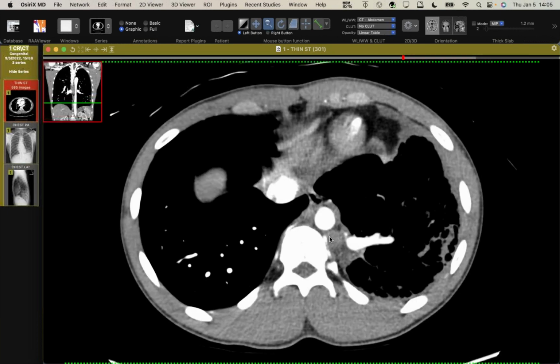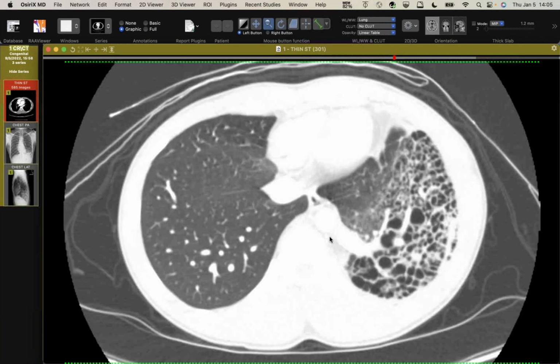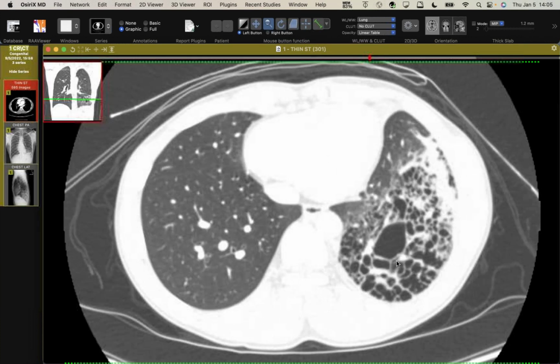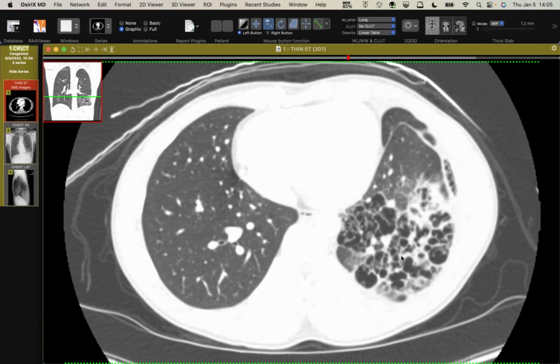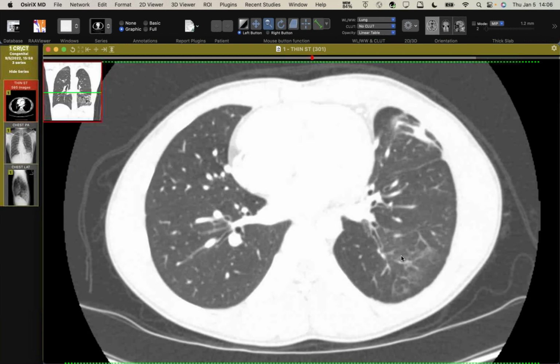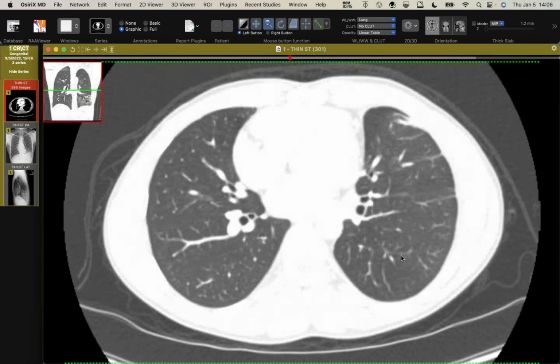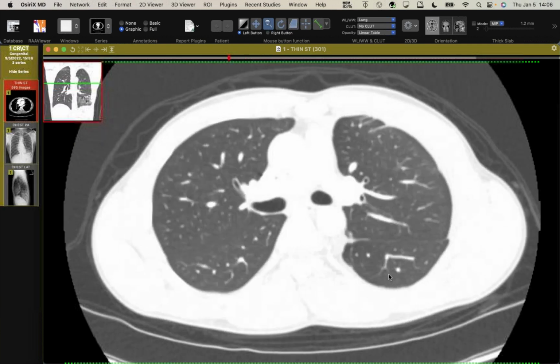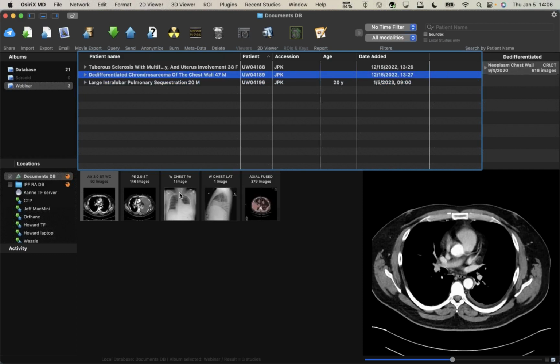that's in this left lower lobe that presumably has become infected more than once. And I wonder if it's a hybrid lesion, hard to tell, but it's clearly had problems for a while. But this was the first time we had a contrasted study to see that. So probably one of the largest supplying arteries I've ever seen. And you can see the little bit of scar there, but the rest of the lungs are normal looking. So, intralobar sequestration with a giant supplying artery. This is a kind of impressive case.